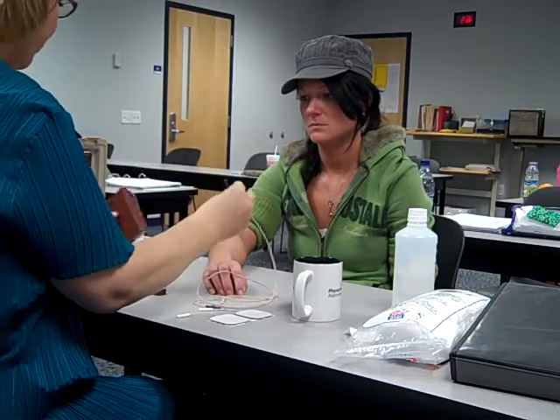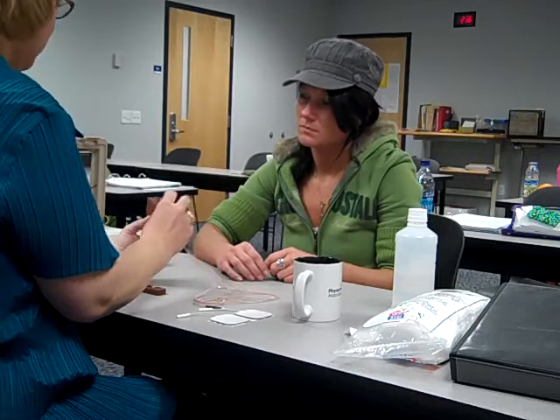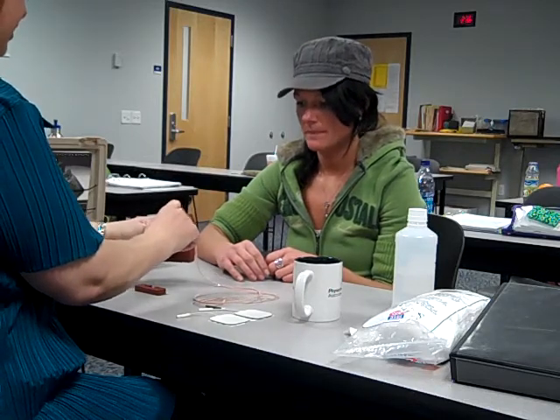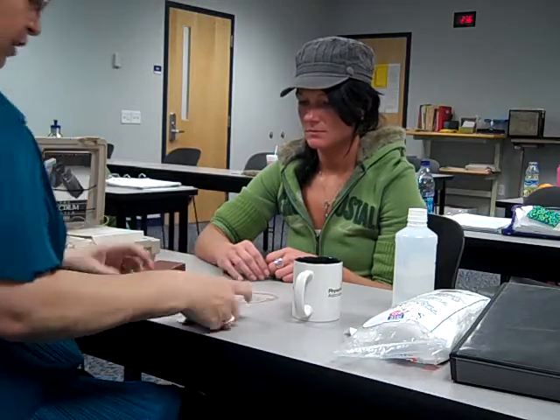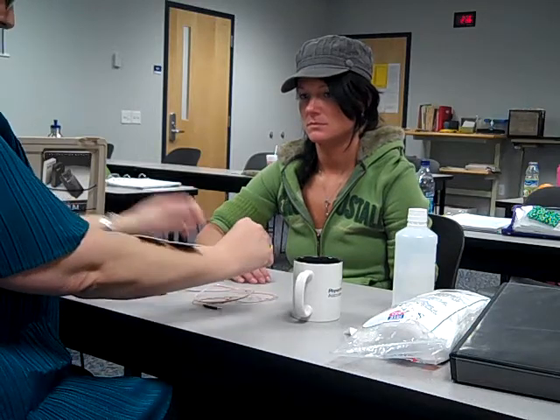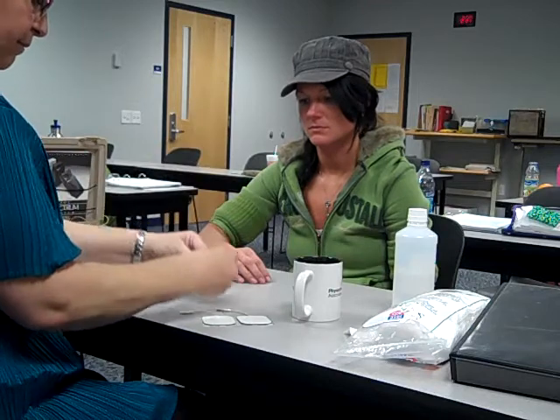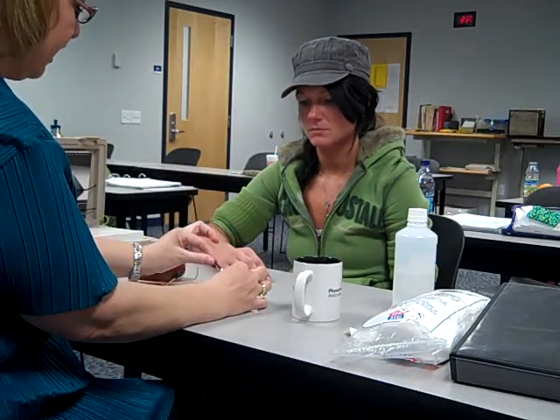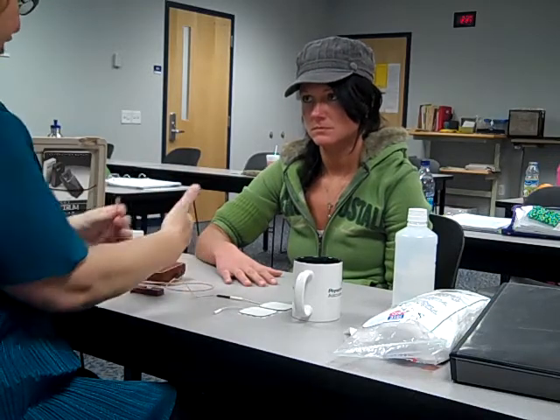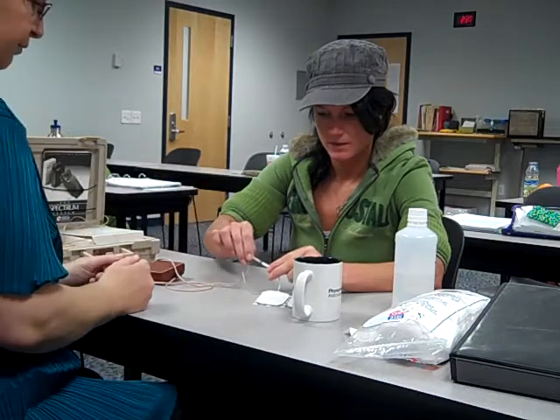Patient, this is the lead wire. I'm going to have you take that and plug it into either one of the ports — port A or port B. Since you put it in the bottom one, port B, we're going to use the B button to turn up the intensity in a few minutes. When putting the electrodes onto the lead wires, do that before you put the electrodes on your body — because if the electrode is already on your skin, you can't plug in the wire; it's a two-handed activity. Always plug the lead wires in first. Notice when I put it in, I push it all the way with no metal showing. There's a brown one and a tan one — color doesn't matter on this type of unit.